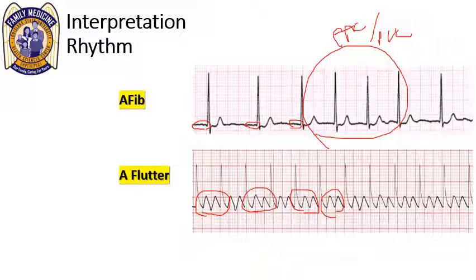Now, one could say, well, it looks pretty regular. It does look kind of regular, but then you have these little irregularities where we lose some, gain some boxes, we change some. So you have to be aware of your context clues here.